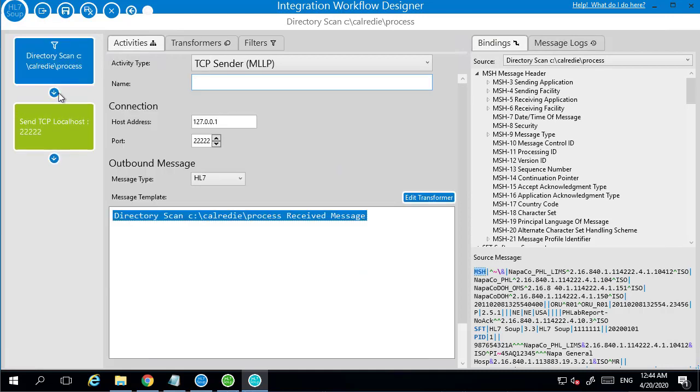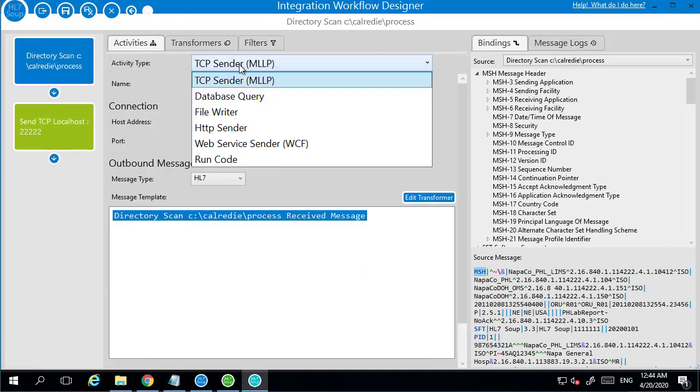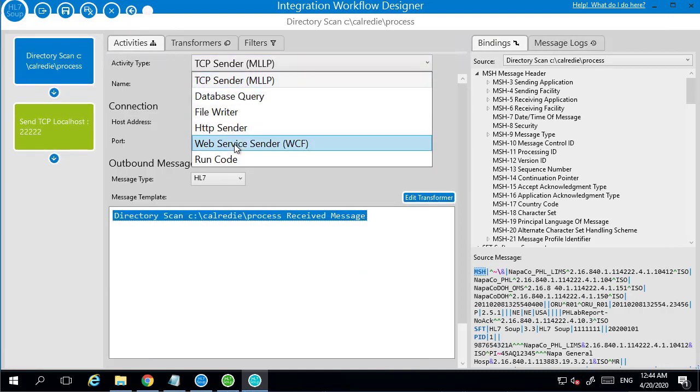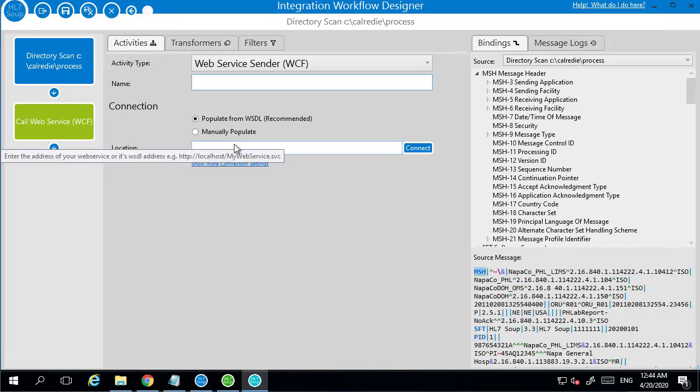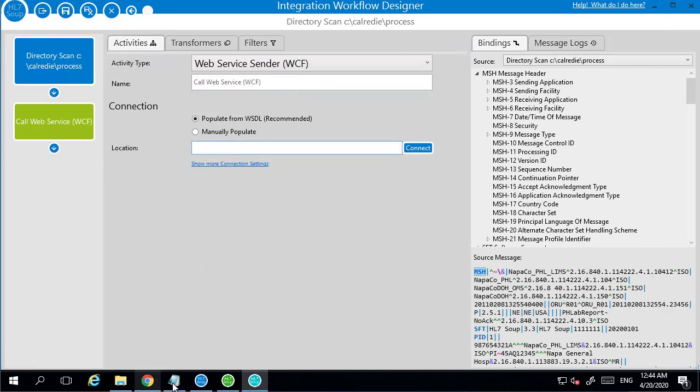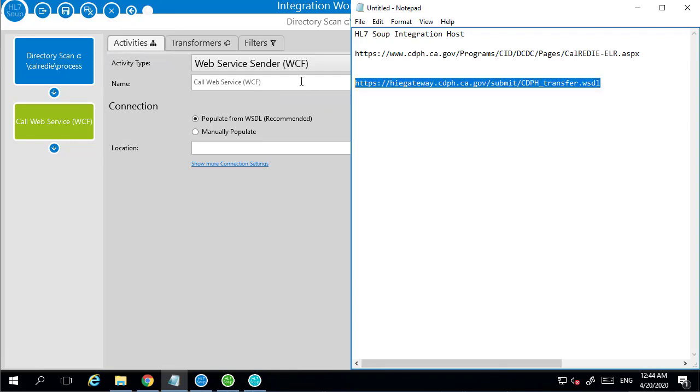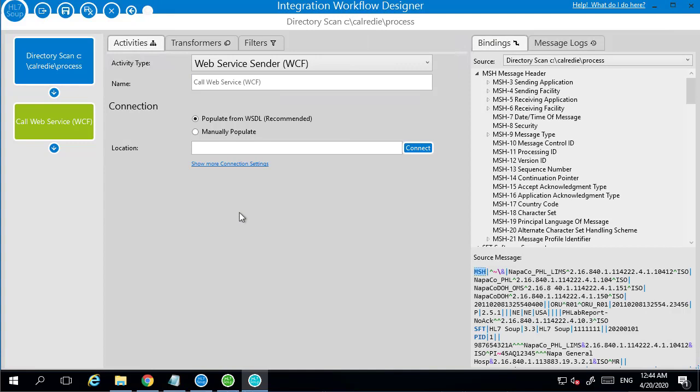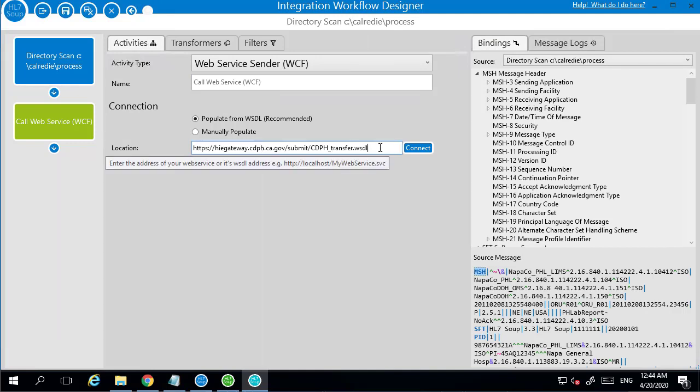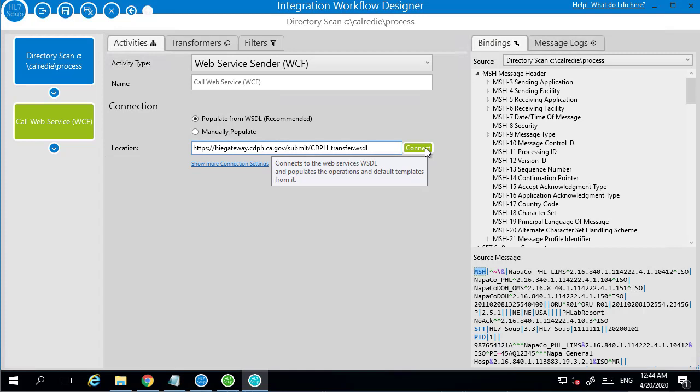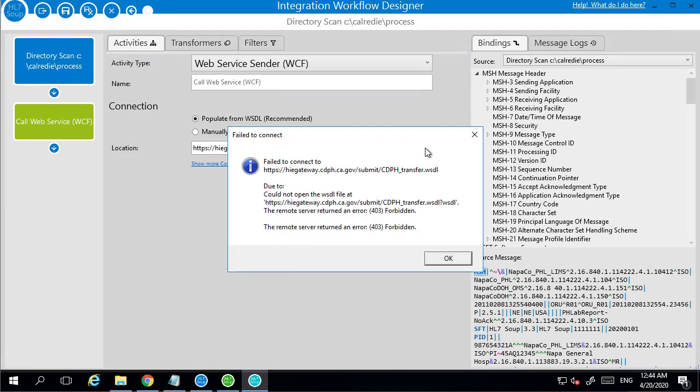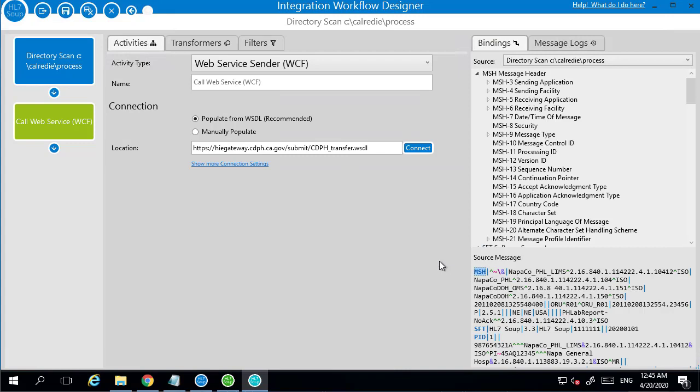The next step, we are going to now send it through to the web server. So we'll click on a web service sender. We just need to get the location of it. And here is their WSDL address. I just happen to have that put aside, it's easier for me to get to. I'm going to paste that in here. Now I'm going to try and connect, and this is going to fail. The reason it's going to fail is because we don't have the certificate installed.